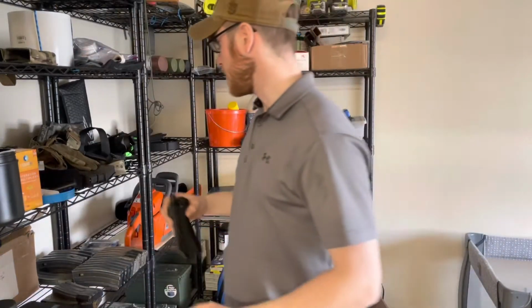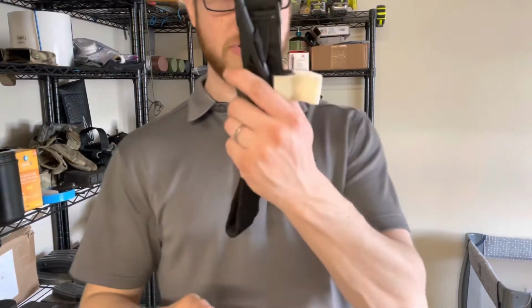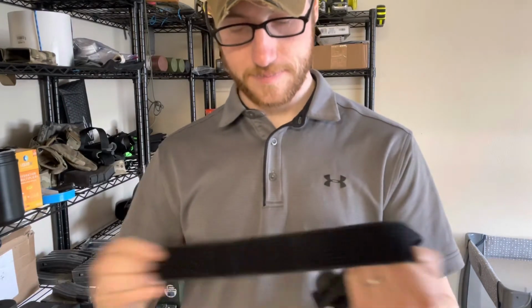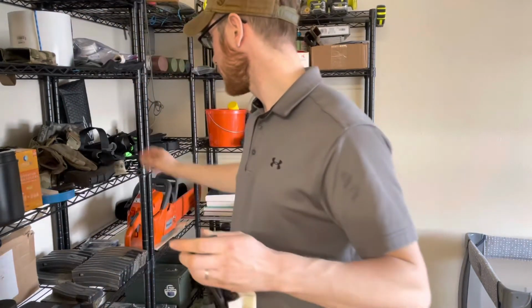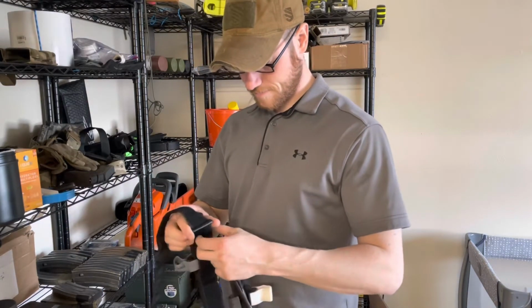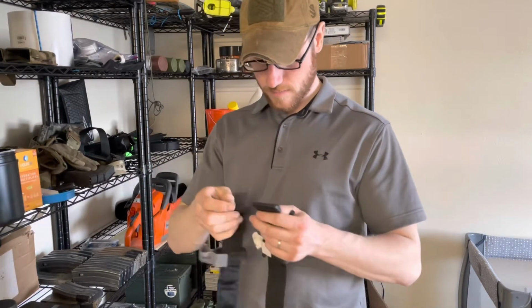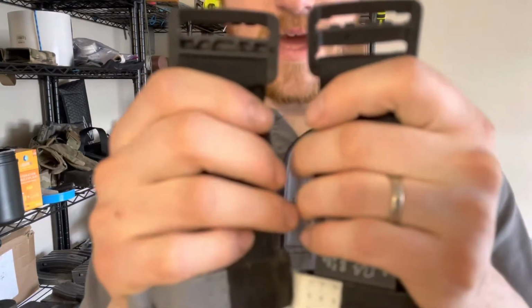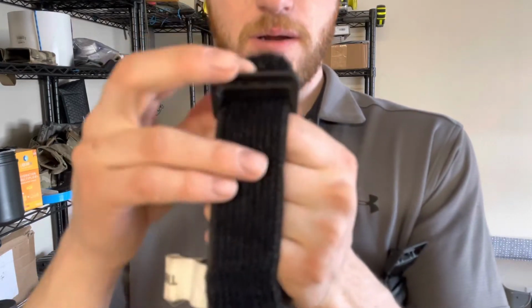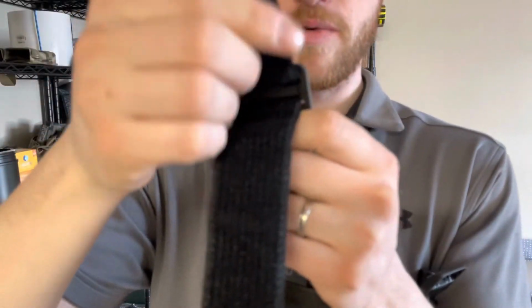So, with the training tourniquet I'm going to be using for this demonstration, we have an earlier generation CAT tourniquet that has a dual friction adapter. I'll show you the differences here in a second. So you can see this is designed to have the strap go through here and then back through here. That is the way that it was intended to be used.